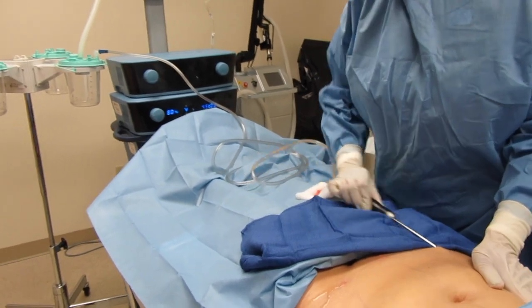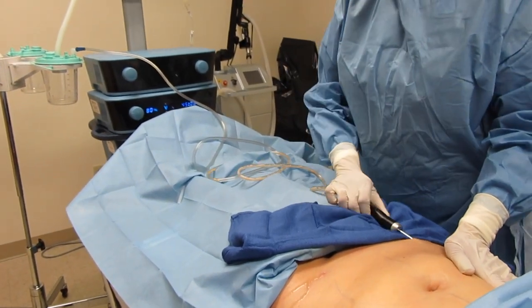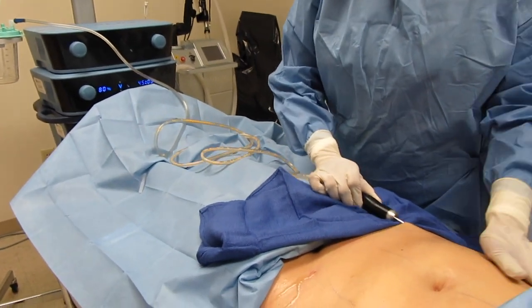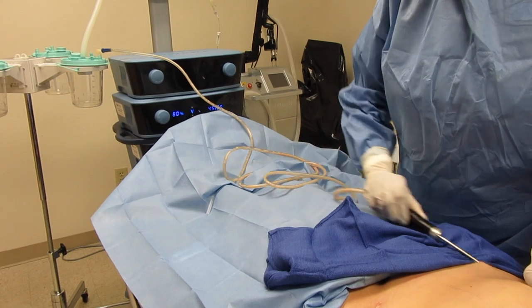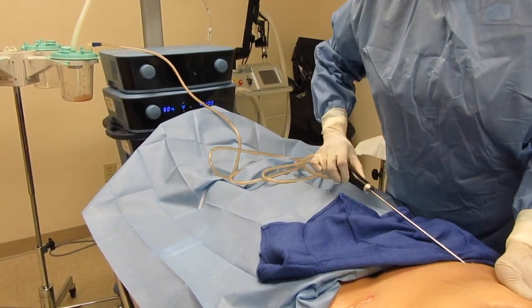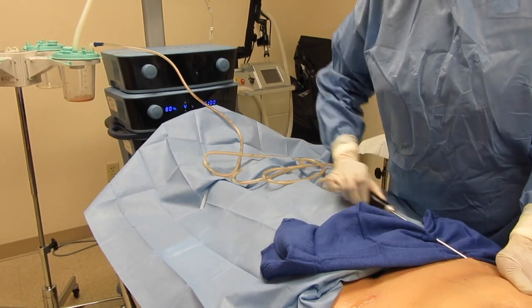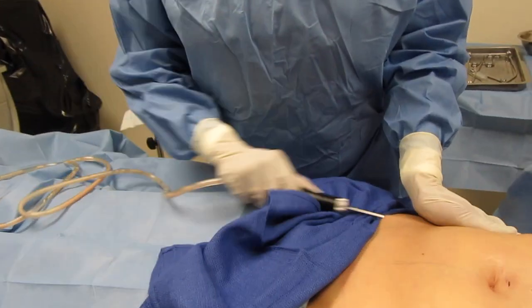We are suctioning. It's all melted fat. So we're going to do this for the next 10 minutes. Okay, you doing okay? Mm-hmm.